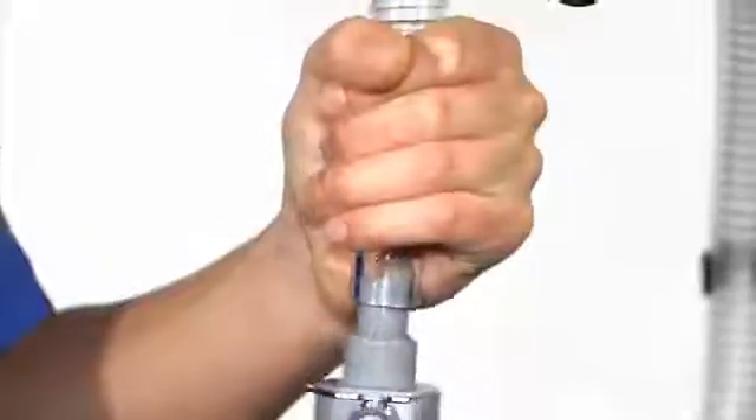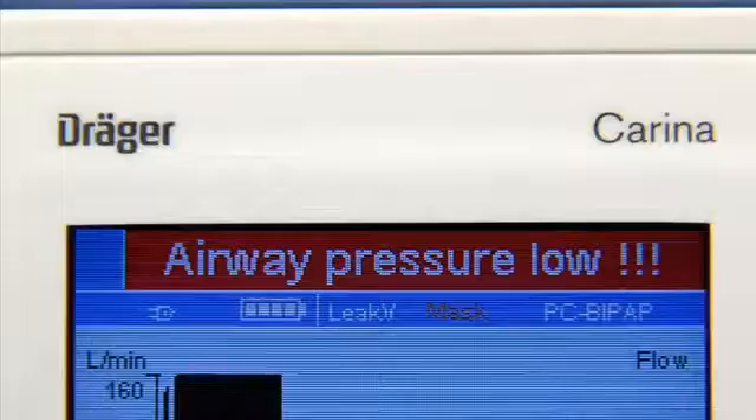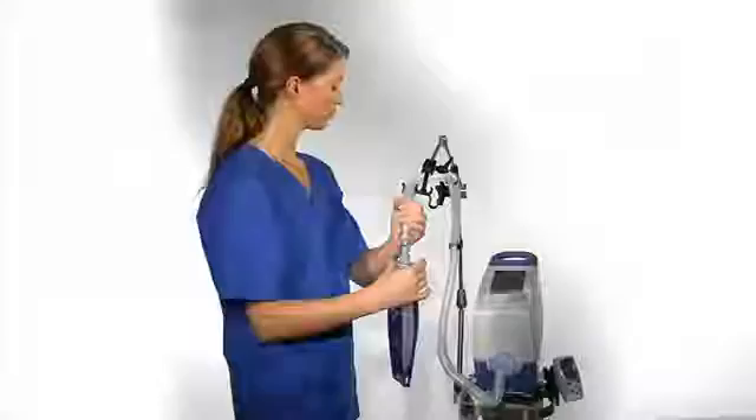Disconnect the test lung from the hose system. Immediately, an alarm tone will be activated and the alarm message airway pressure low will appear. Please reconnect the test lung following the activation of the alarm.